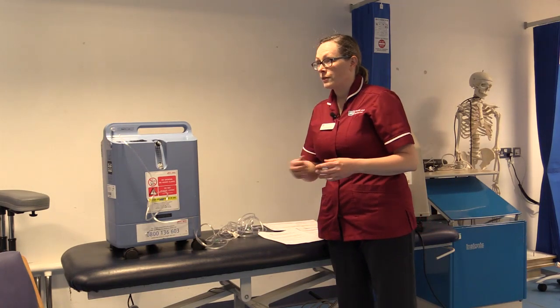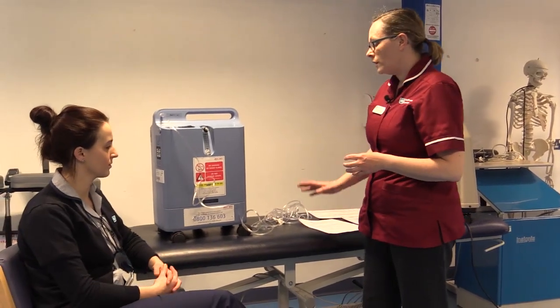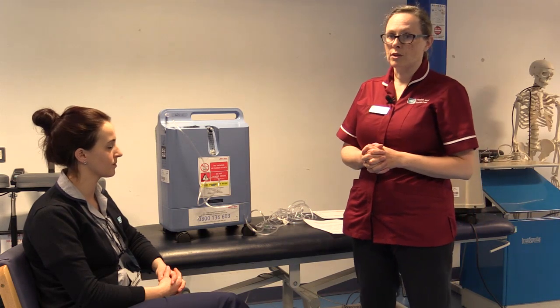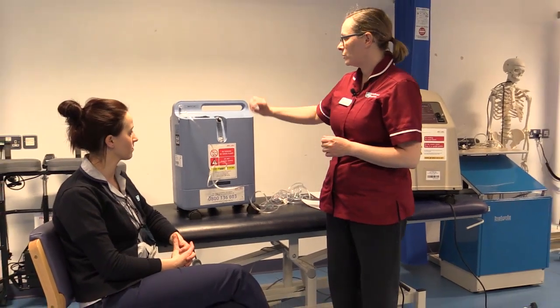So when you arrive at the house with a patient, you will carry out your normal infection control procedure. You will check the Cardex. You will gain the patient's consent to ensure they're happy for you to commence their oxygen if it's not already in place.